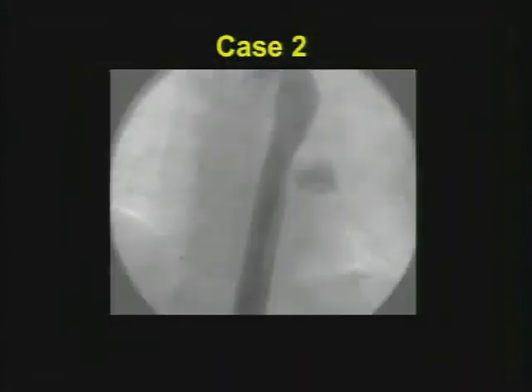Case number two: a few images from a thoracic aortic angiogram. Clearly something's amiss. What is your differential? How might you treat this patient?